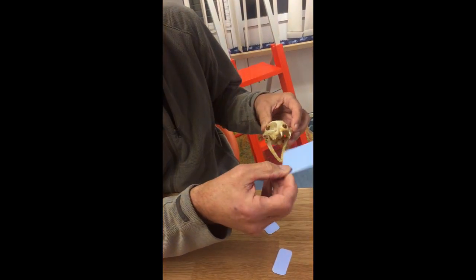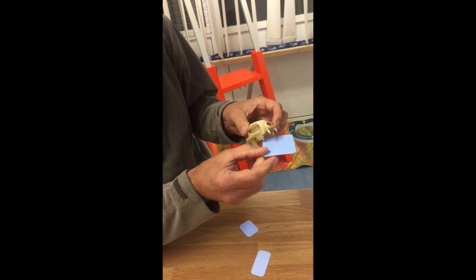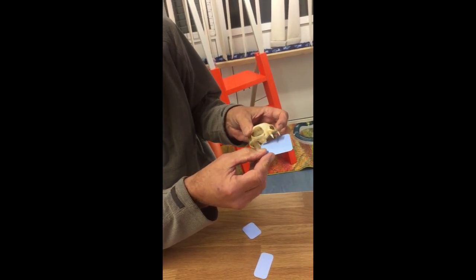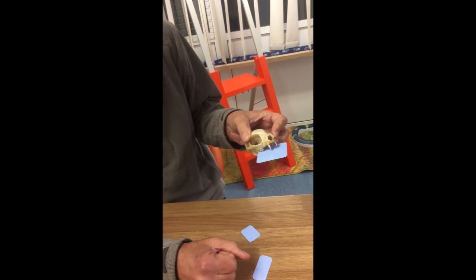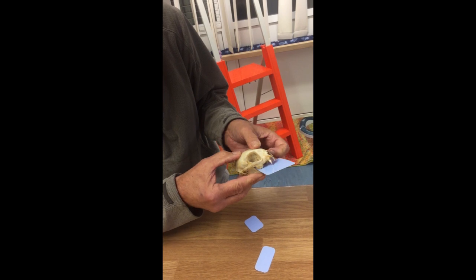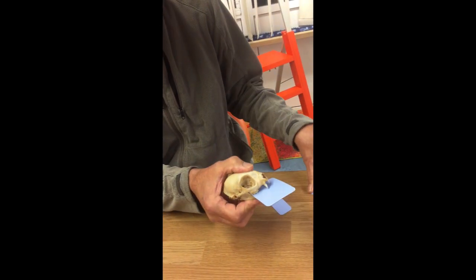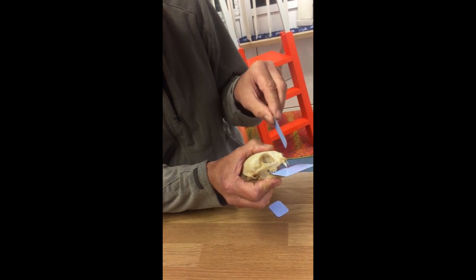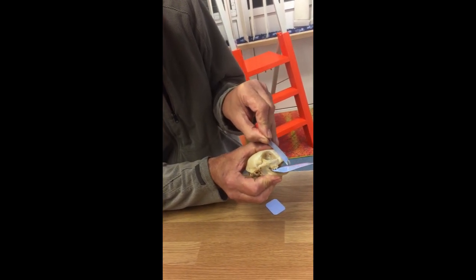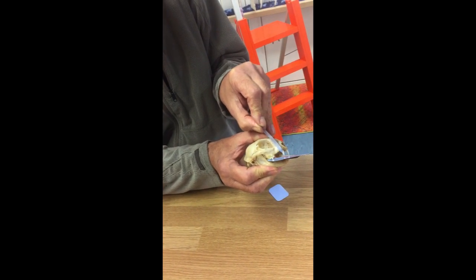First of all, we shove our film in the mouth, not like so at the flat end. Put the corner in, it gets it farther into the tooth. Now, when it comes to the angle of the tooth, this is where we start our bisecting angle. Basically we have to create a line from the tip of the tooth to the apex of the tooth, and you should be able to see down there, and that is the angle which we are then going to bisect.